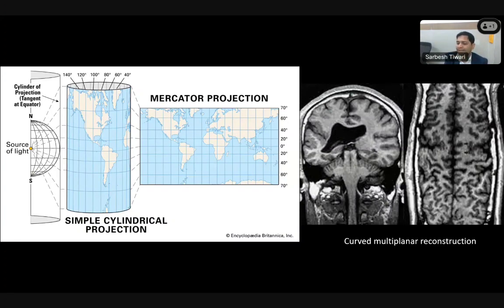T2 relaxometry is not a primary sequence for all patients with epilepsy. All right. T2 relaxometry should be done only when you are suspecting a bilateral MTS and you're not sure about it. And like we have used it, we have not found it very informative. We do it only when we have a doubt of bilateral MTS. Okay. All right. So this was well attempted.